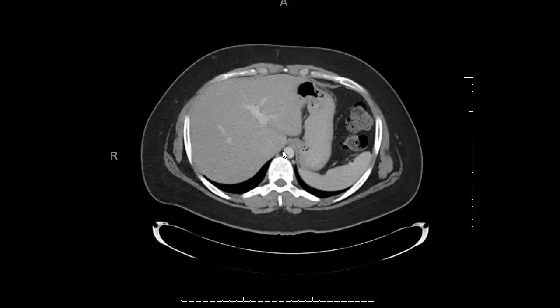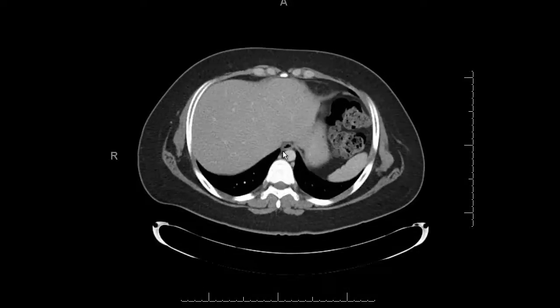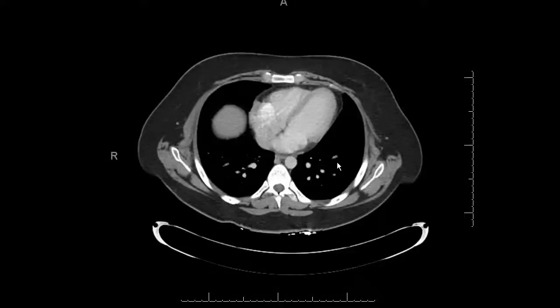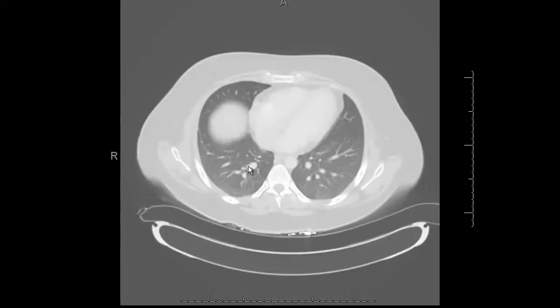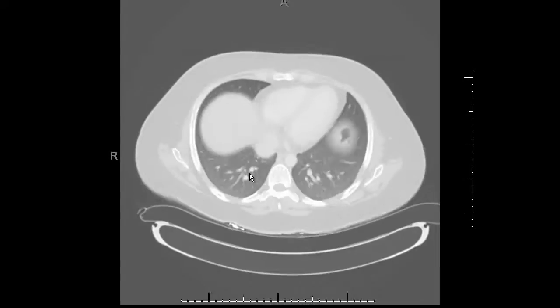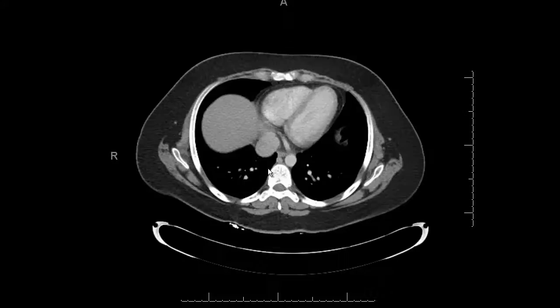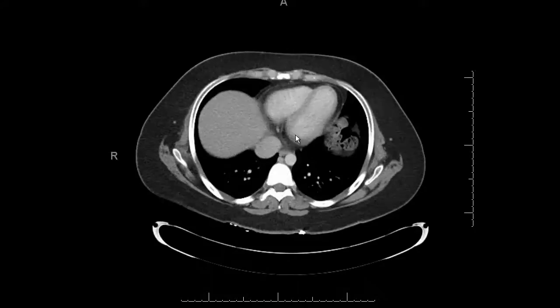I also look at the pulmonary arteries. Sometimes it's hard to distinguish arteries from veins, but you can go on lung windows and look for vessels that follow bronchi — those are the arteries. I'll look for PE, but I do that quickly.